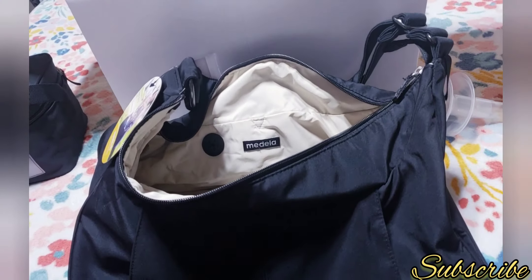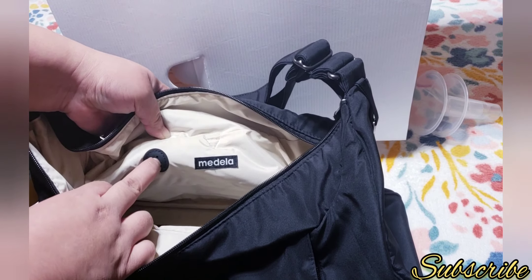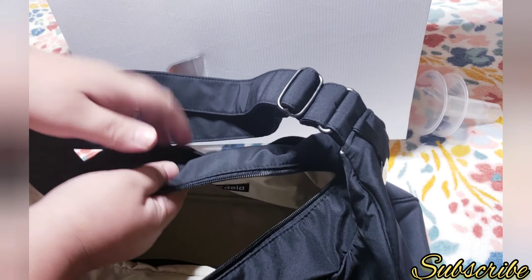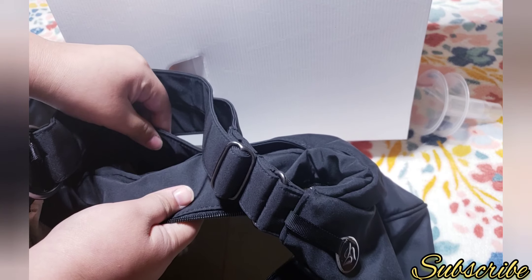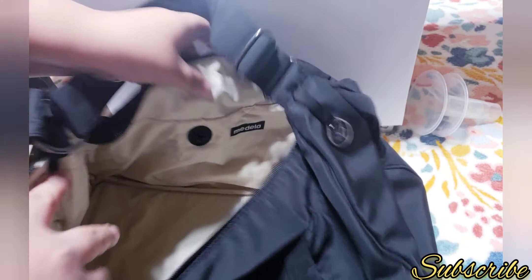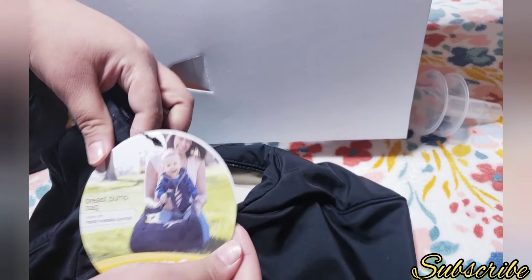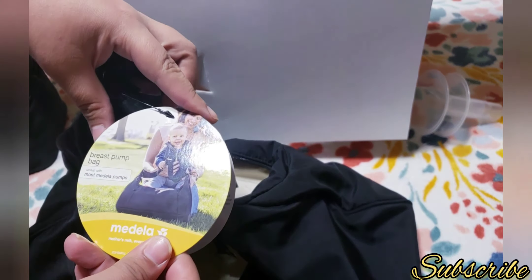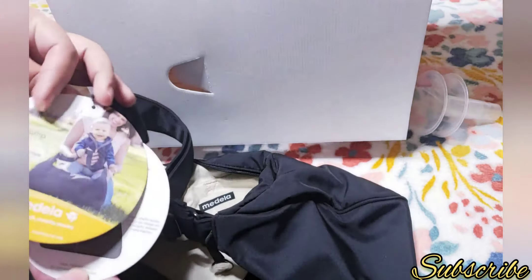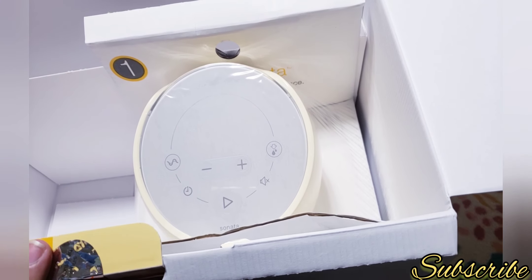On the back it says Medela, and there's a little hole where you could feed the cord plug through, put your breast pump inside, and just plug it into electricity. You could also keep your cord inside the bag if you want. It's a good size and I think it's insulated. It works with most Medela pumps, so you can use it with multiple pumps — smaller ones too. There's also some information about the bag inside.